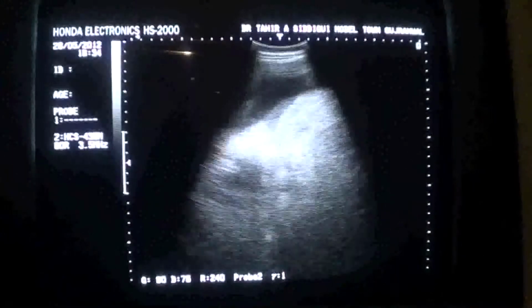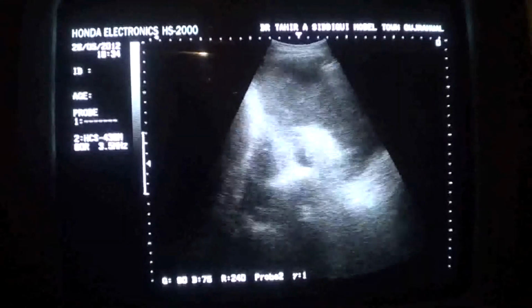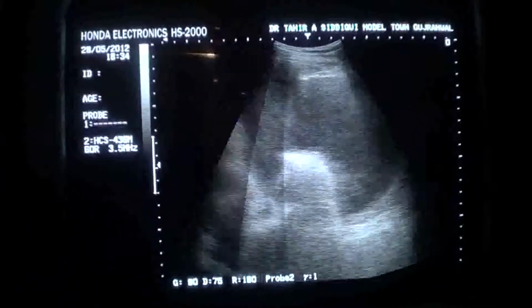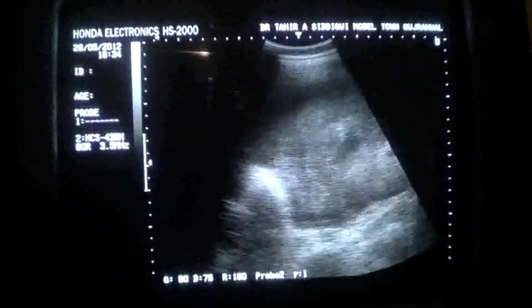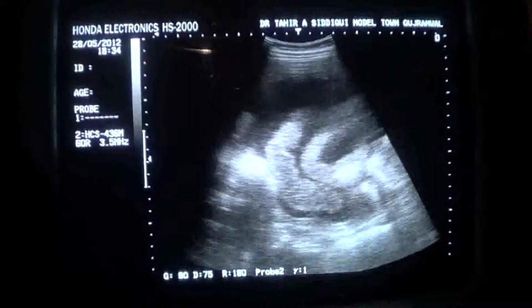And this is the fluid in which you can see, this is in all of the abdominal cavity totally. Hardly any fluid area is spared. This is bleed within the fluid, and now in this portion we see a bit clearer fluid with very little echoes in it.